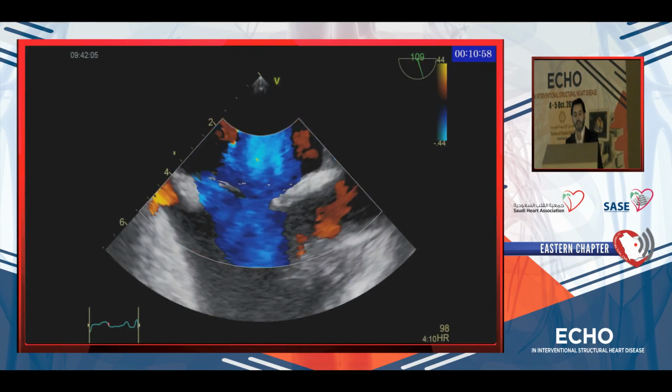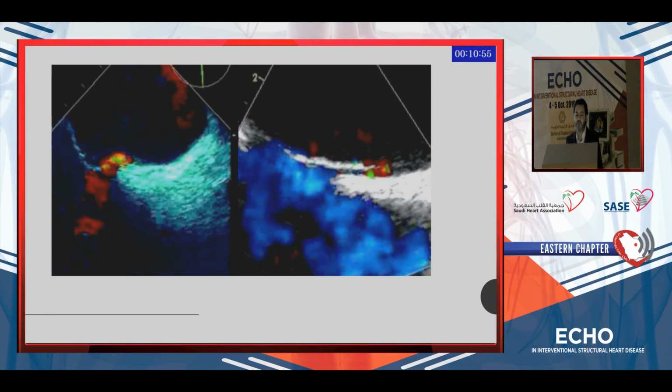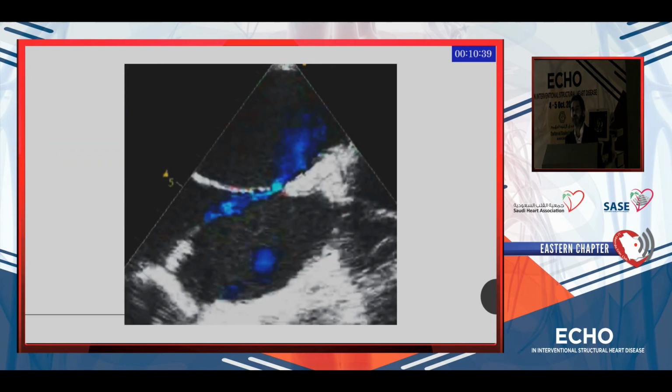Okay, so this is an example, and you're looking mainly for this red signal, which is right to left as a cause of stroke. However, sometimes, if you have an atrial septal aneurysm or a stretch, we call it stretch PFO, when the LA or RA is really dilated, you might have a bidirectional or reverse shunt.